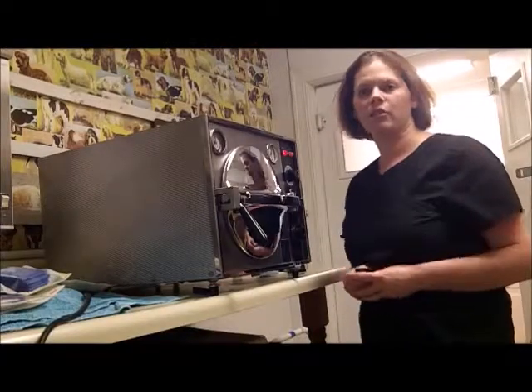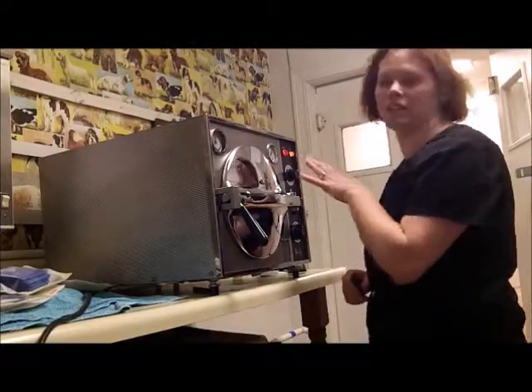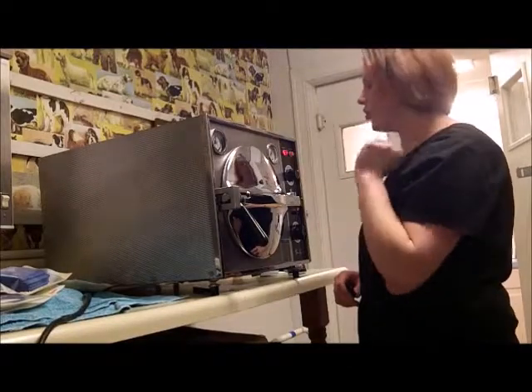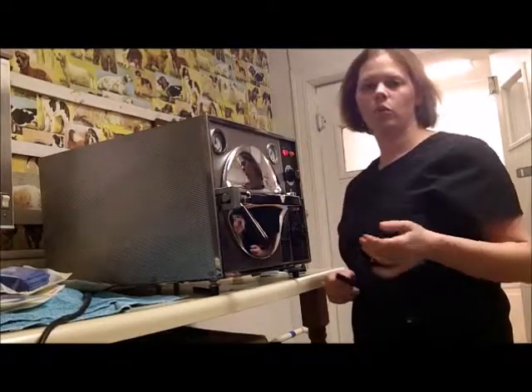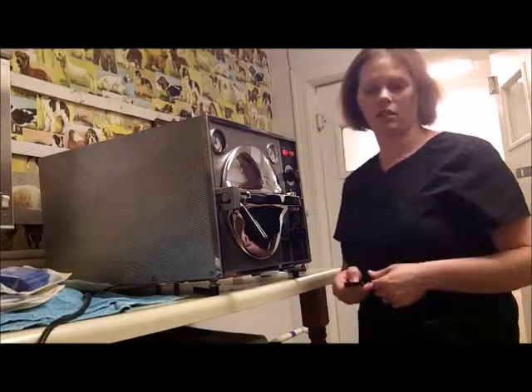So I've just set the timer for 20 minutes of heat sterilization at the appropriate temperature. It's at 266 degrees Fahrenheit. Pressure is where it's supposed to be. So in 20 minutes we will begin our venting after the sterilization process has completed.